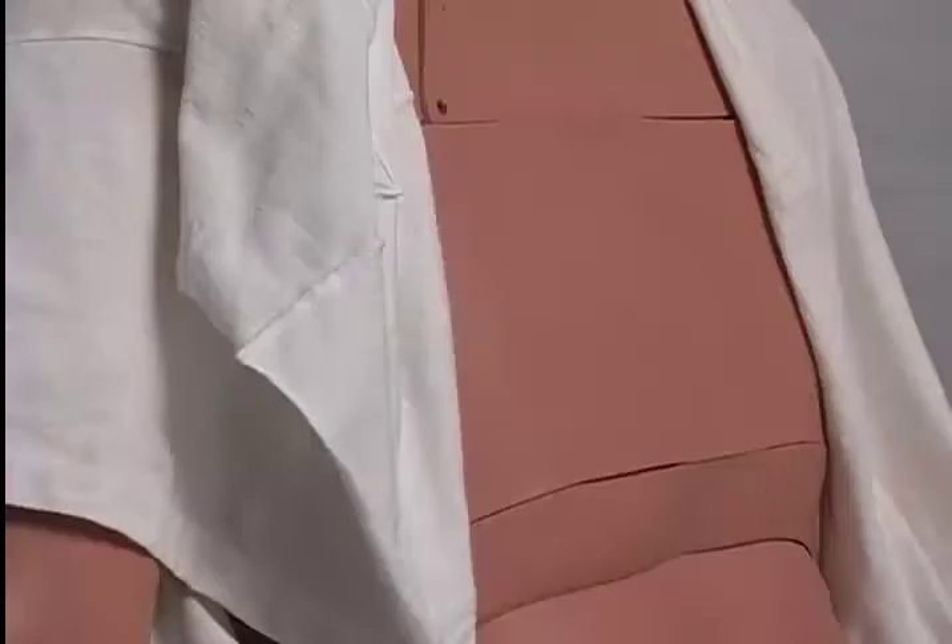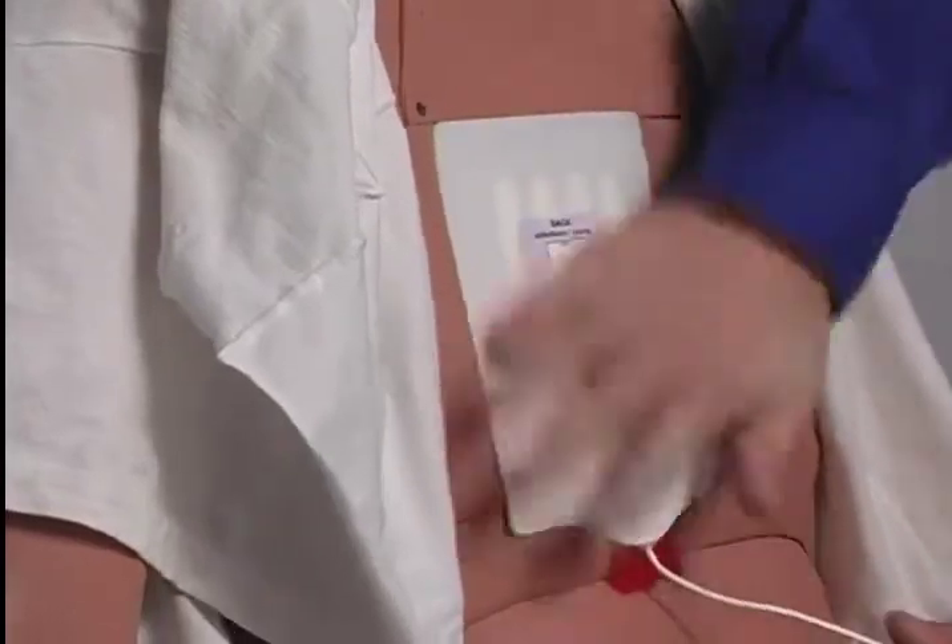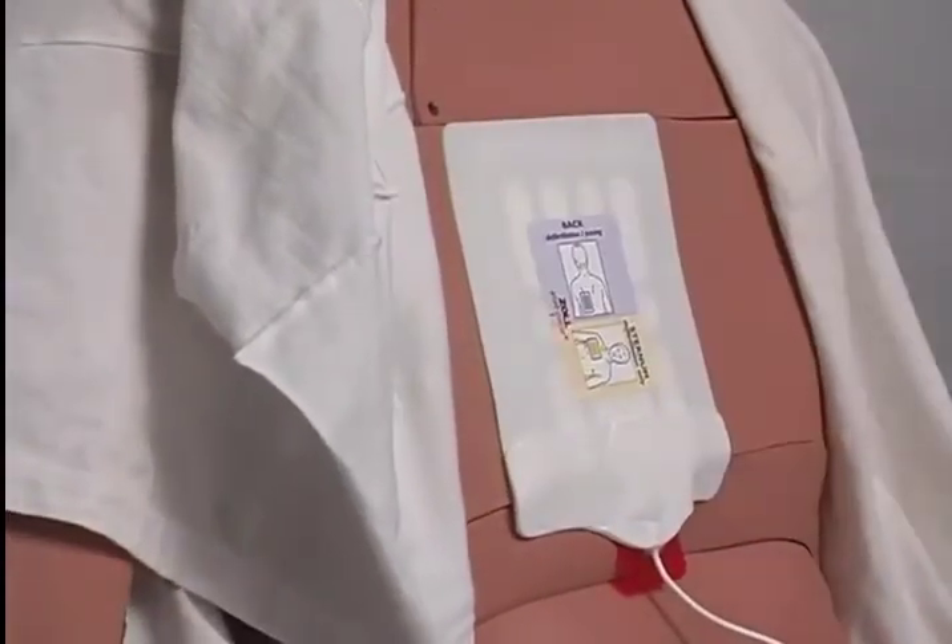Defibrillation pads should be applied according to local protocol. If anterior-posterior is the preferred placement, the back pad should be placed while the patient is sitting up or prior to being rolled onto the board. If apex sternum is standard, both pads should be applied after the patient is placed on the board.